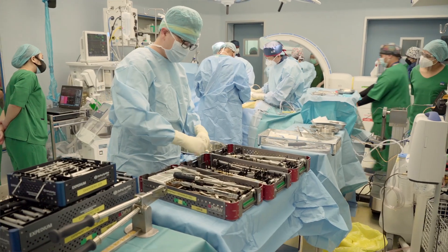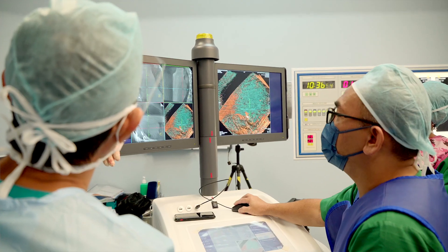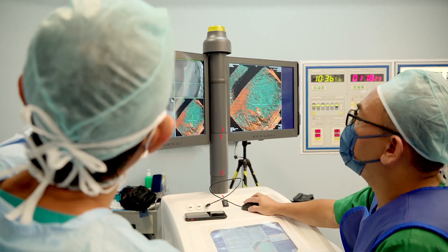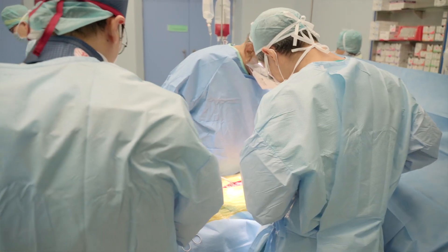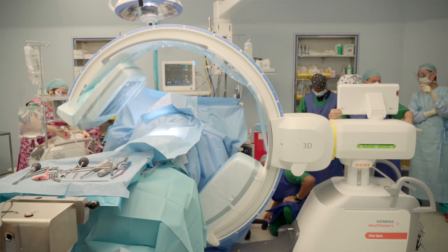In order to correct such a deformity, we need to put spinal implants in the form of screws and rods into the bone. As we know, our spine is complex — we have a lot of nerve structures and the spinal cord — so we have to place them very meticulously so that we don't injure all these important structures in the spine.